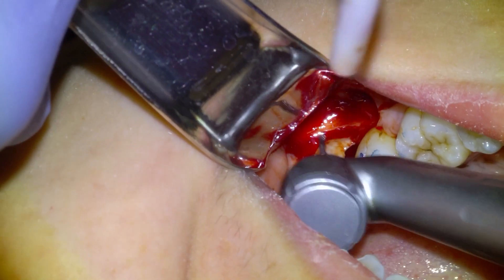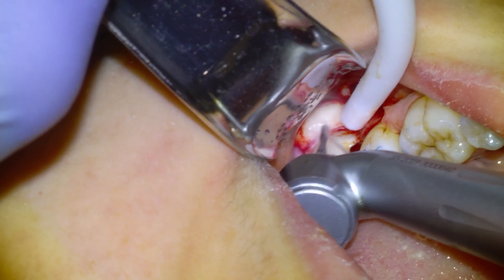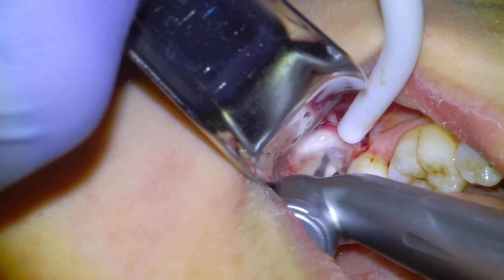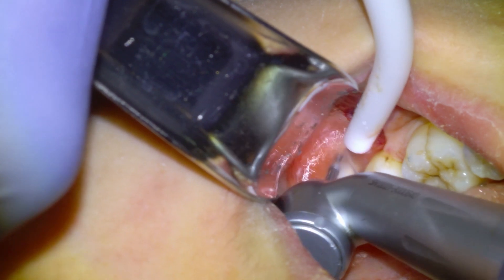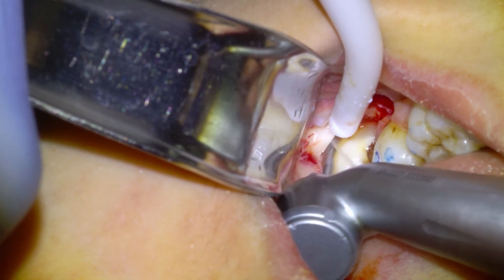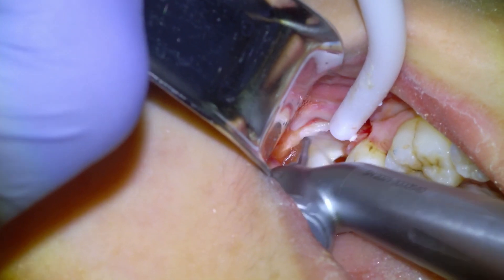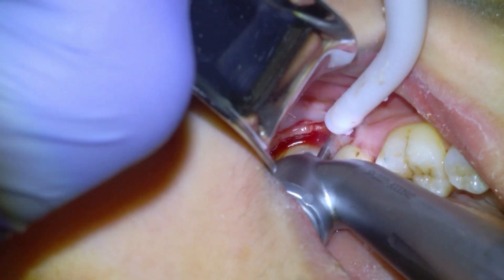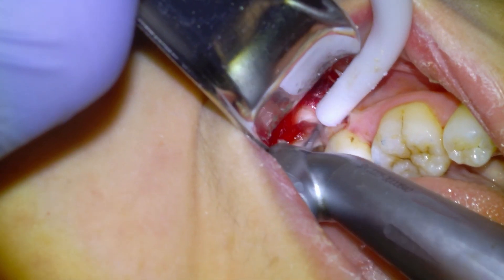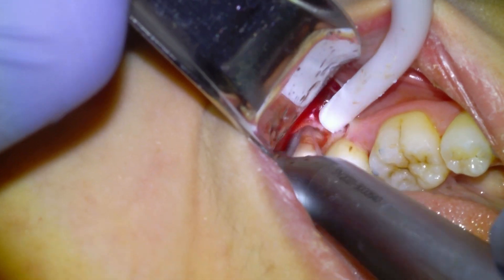Wisdom teeth are encased in bone, which prevents their removal without removing the bone that traps it. Part of the procedure involves making a trough on the cheek side of the tooth where there are no vital structures, so that we can elevate the tooth out of the socket. I'll extend the trough all the way to the distal buccal angle of the tooth, and make it a little wider in the mesiobuccal because that's where the elevator goes in — I like to get it as deep as possible. We'll make a little purchase point there for the elevator.